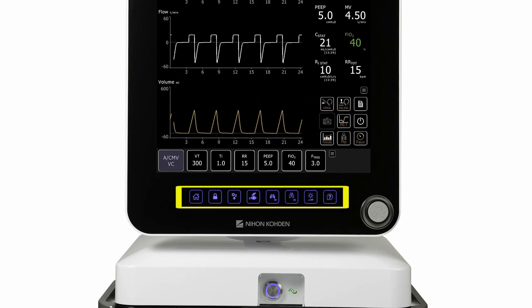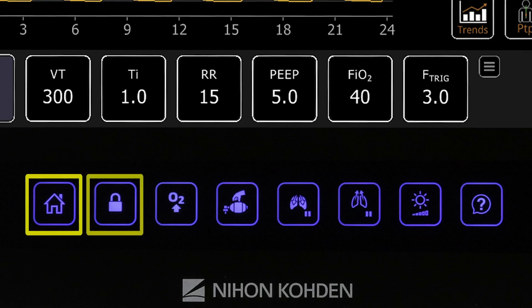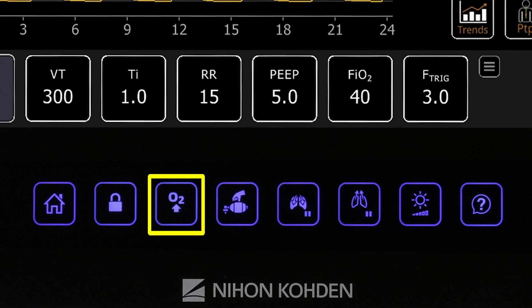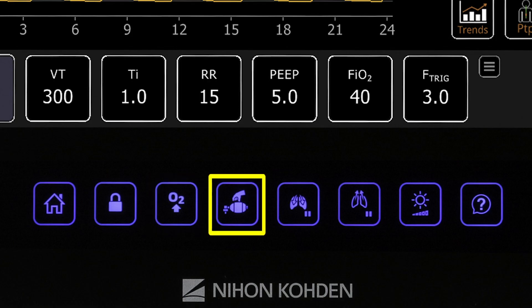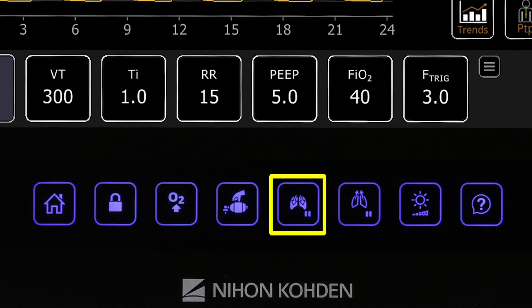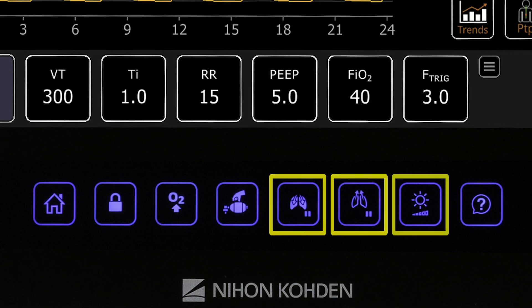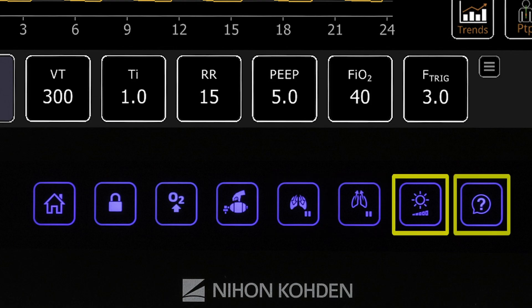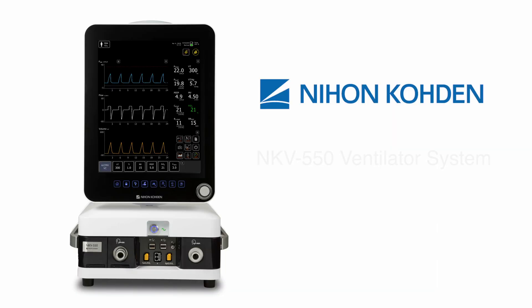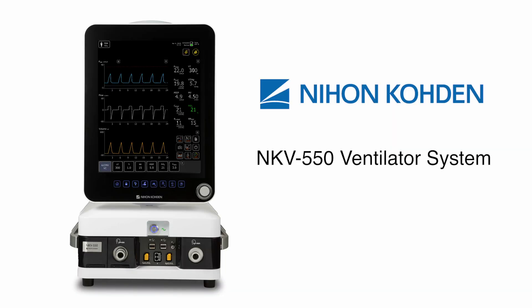The quick access area provides buttons that allow clinicians to navigate to the home screen, lock or unlock the panel, provide elevated O2, deliver a manual breath, perform an inspiratory or expiratory hold maneuver, adjust screen brightness, and get access to on-screen help. This concludes the NKV-550 System Overview. Thank you.